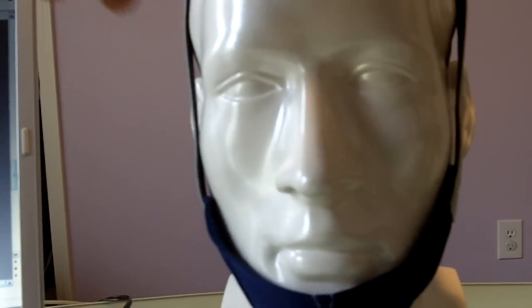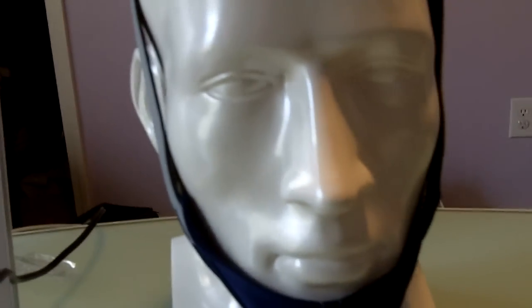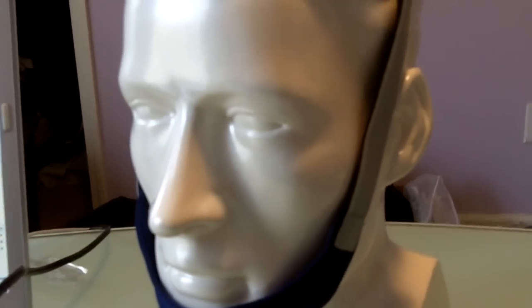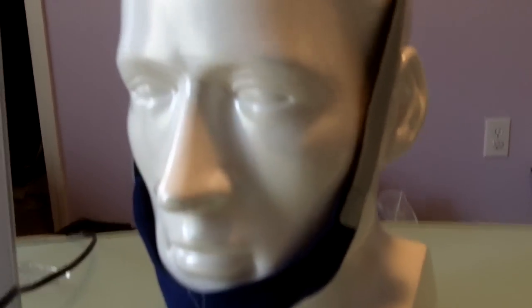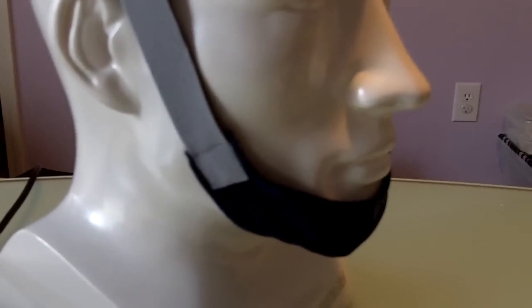This is the ResMed Chin Strap. It is a very good chin strap. I want to go over the strengths and weaknesses as shared with me by my sleep apnea patients.